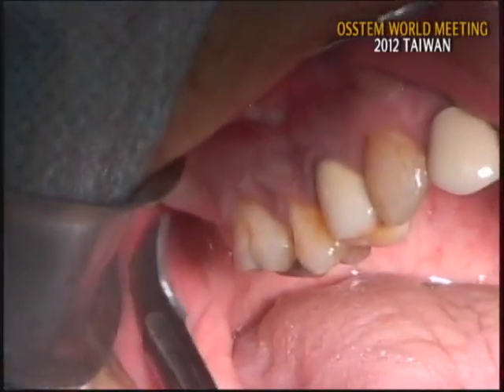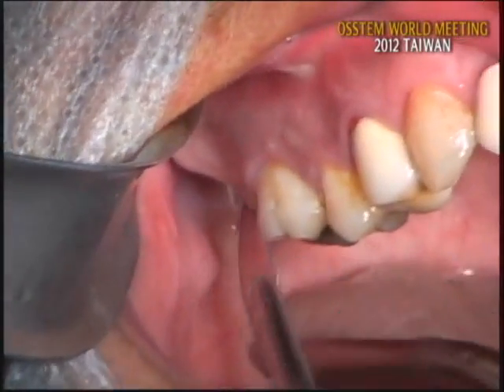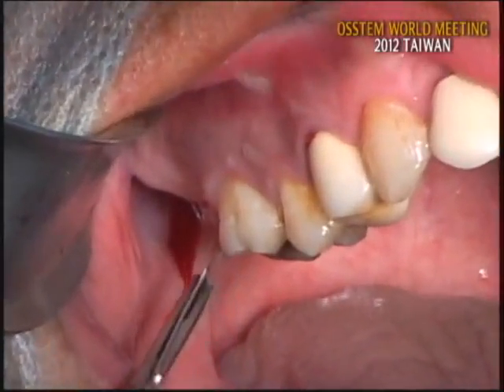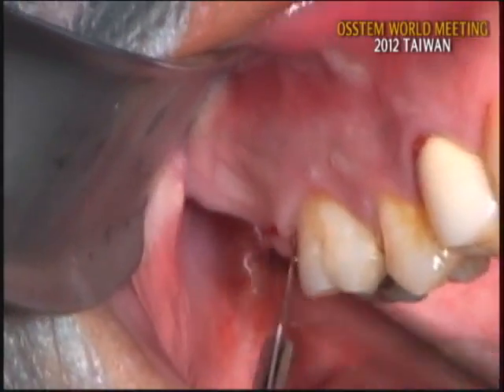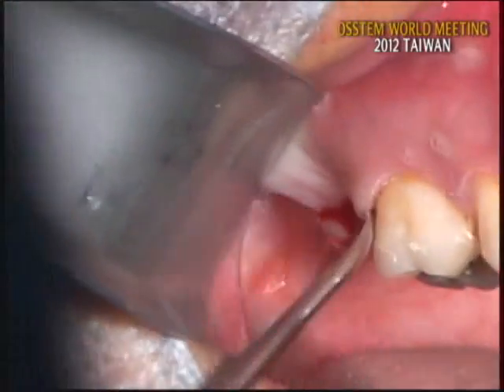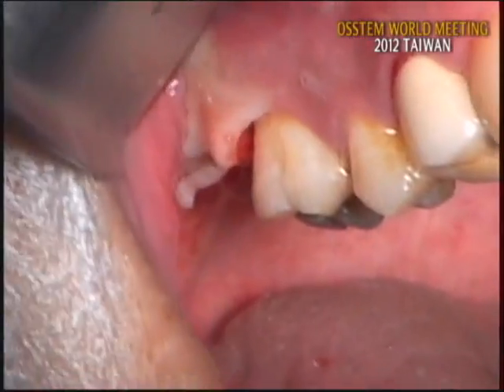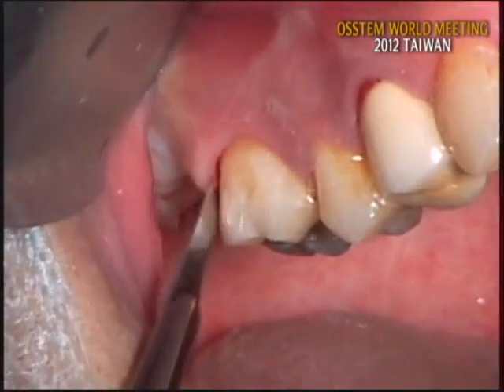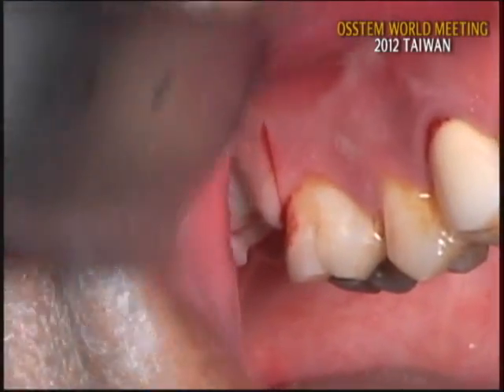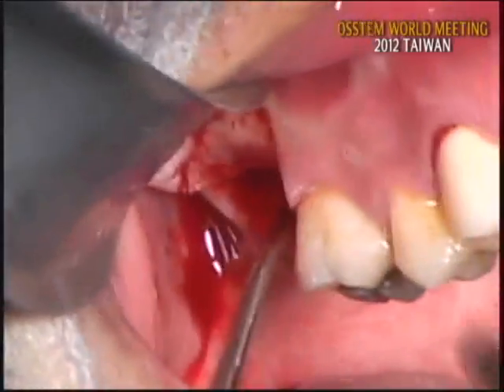I'll make a small incision in this site. The gingiva is very thick. Okay, left turn. Let's expose the alveolar bone. For a good surgical field, I will make a small vertical incision. Usually I omit this one, but today I'll show this one. Now the bone is exposed.